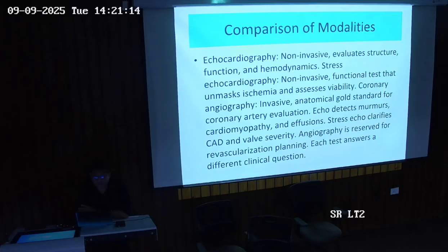Echocardiography is non-invasive, so it is a better choice. It evaluates the structural and somewhat functional aspects also. Hemodynamic stability or instability can be detected by the echo. Stress echo is also non-invasive. It is a functional test that unmasks ischemia and assesses the viability of the myocardium.